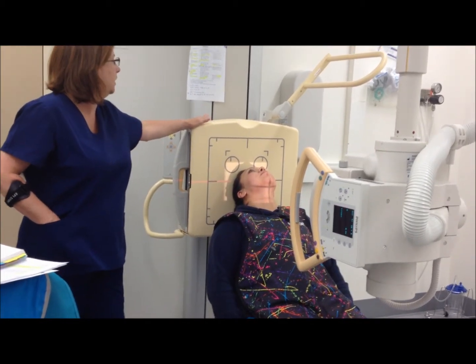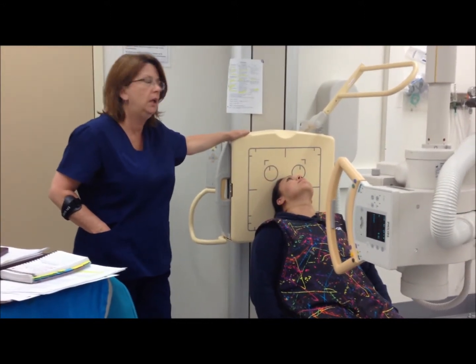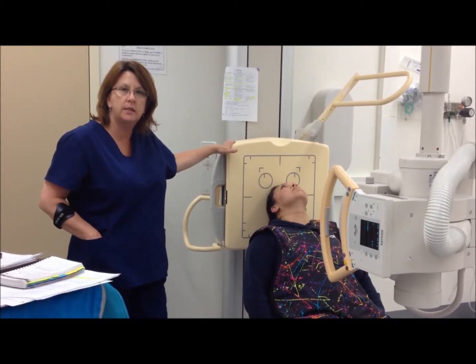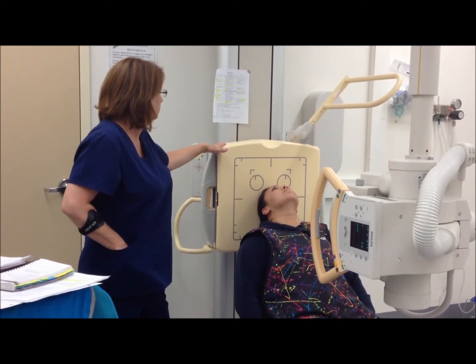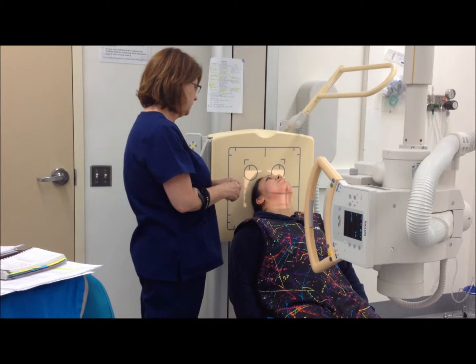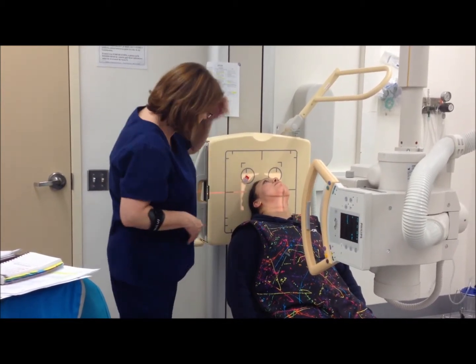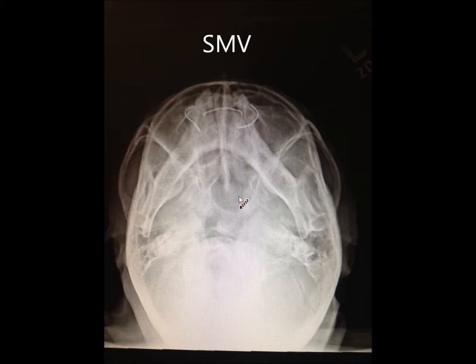We're going to be using a kVp of 70 and a mAs of 20. We're going to be looking at the ethmoid and sphenoid sinuses in this exam. My marker on the board, patient's right side, getting light out of the patient's shadow. That's it.